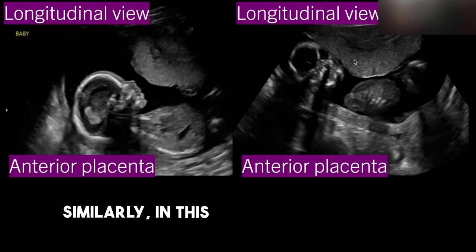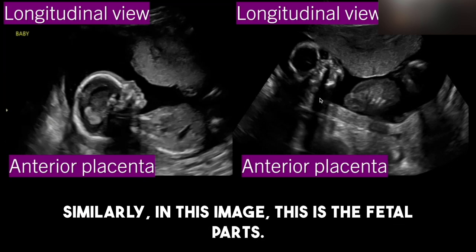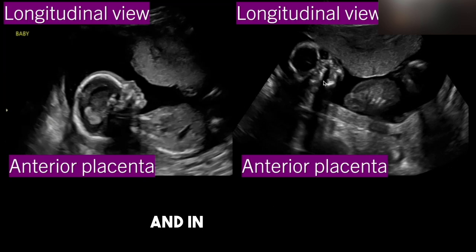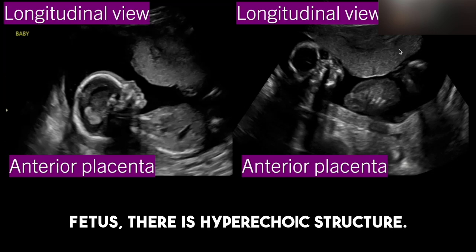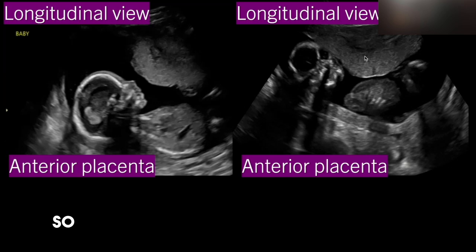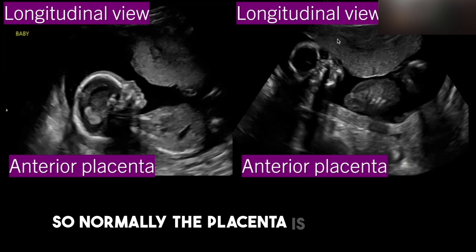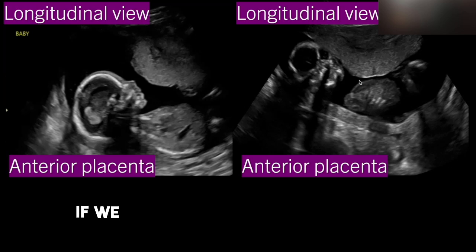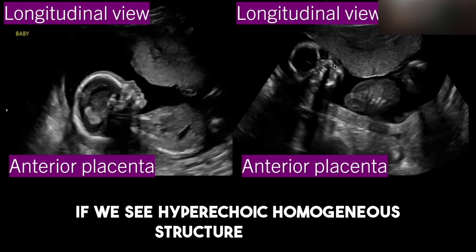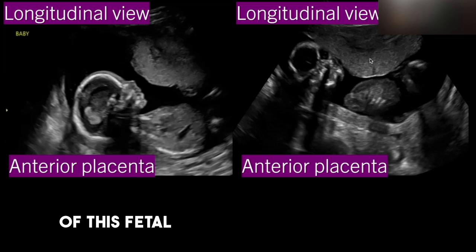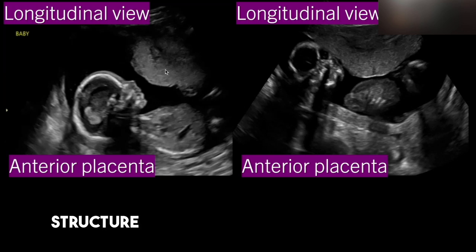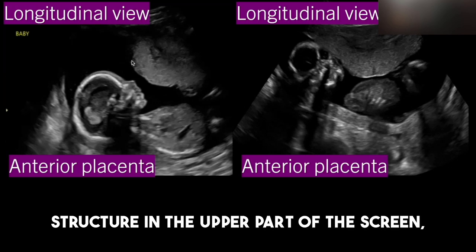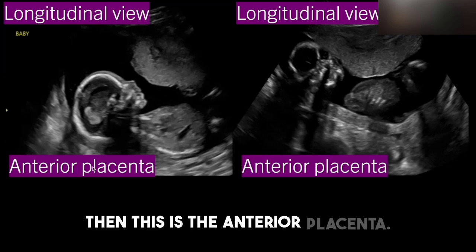Similarly, in this image, this is the fetal parts and in front of this fetus there is a hyperechoic structure. So normally, the placenta is hyperechoic. If we see a hyperechoic homogenous structure in front of the fetal part, if we see a hyperechoic structure in the upper part of the screen, then this is the anterior placenta.